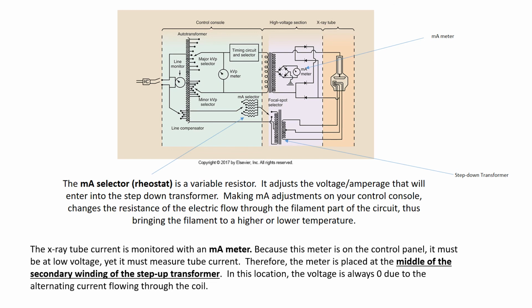That terminology must be memorized. That often is a question on the registry in the physics portion. They'll ask, where is the MA meter located? The MA meter is located, once again, at the middle of the secondary winding of the step-up transformer.